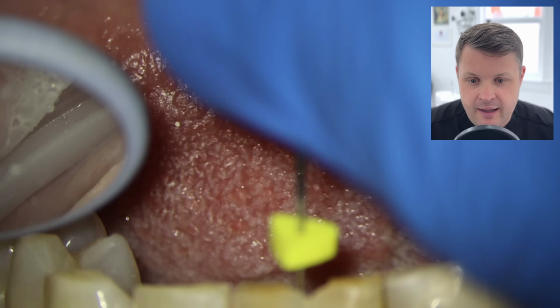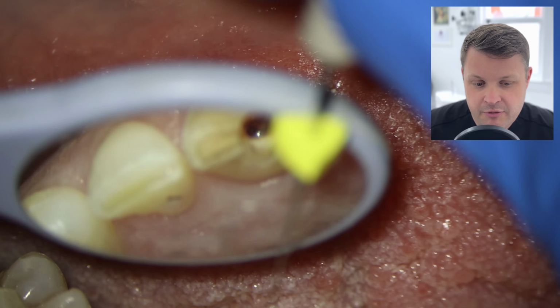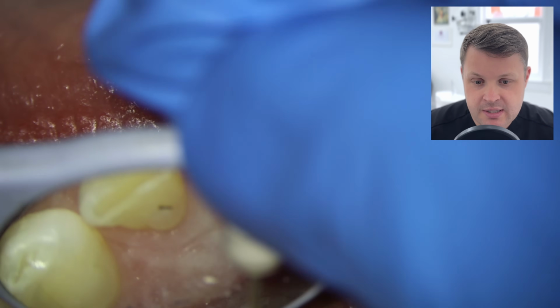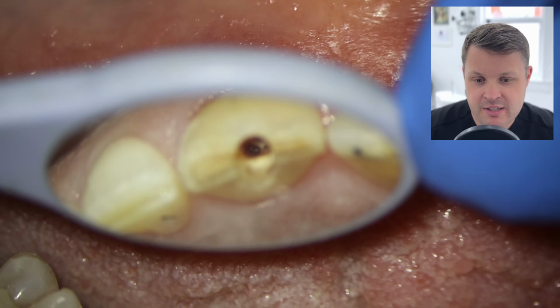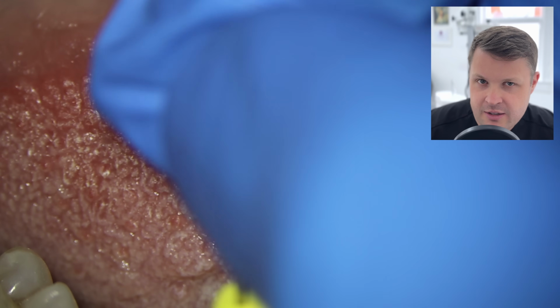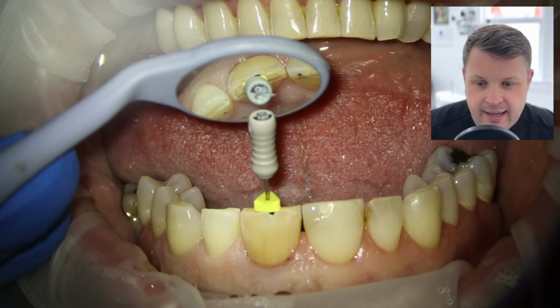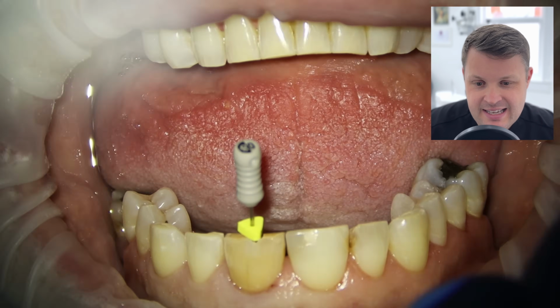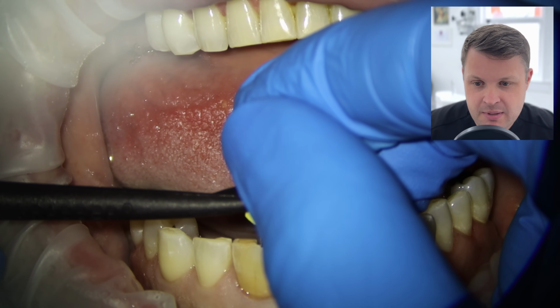And then what I do is I get a size 8D finder and I have a little feel around, and then I feel this kind of breach. And I feel like at this point I have reached this canal orifice. So I have a little feel around. It feels like the file is actually within the canal space, and I hook up my apex locator here, and I can see that actually we are about maybe 16 millimeters.